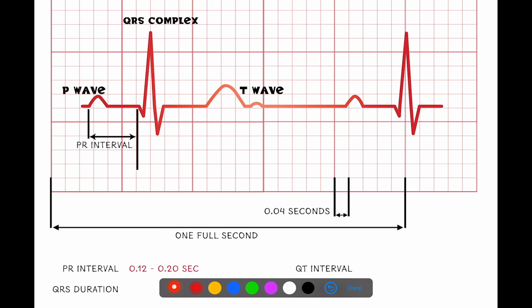And our PR segment up here represents that AV node slowing down that impulse and receives it from the SA node before it sends it down the ventricles. Well there isn't a standard normal length for a PR segment itself. We do however see the PR segment changes in certain types of heart conditions such as heart blocks or maybe a delay to blocking the impulse activity. But we'll go into that later.